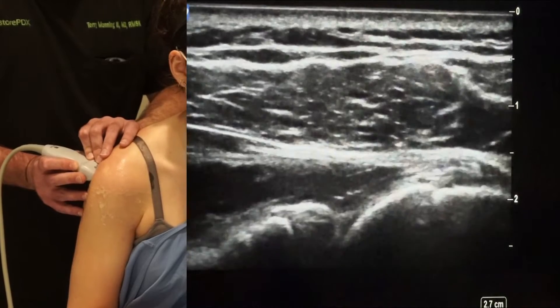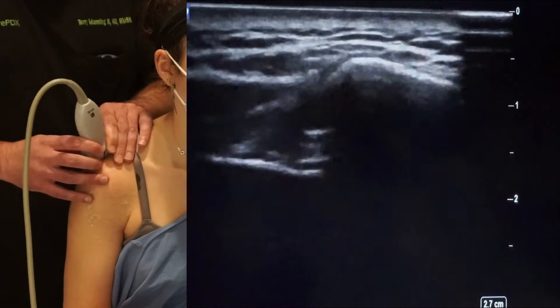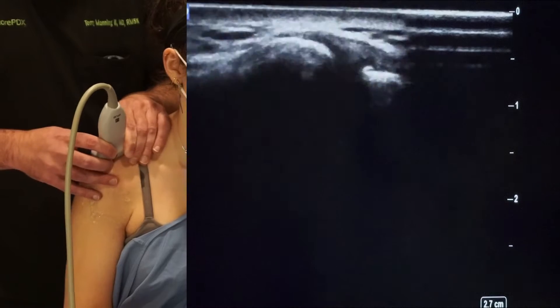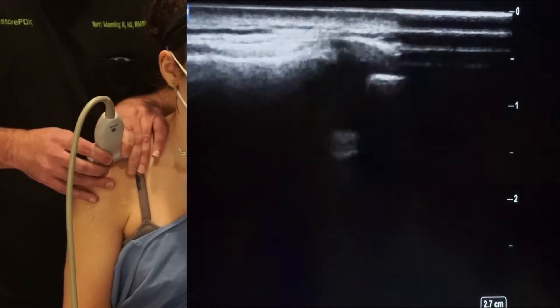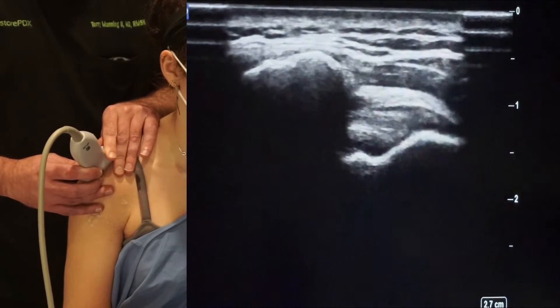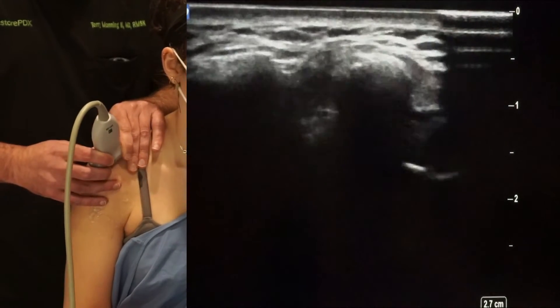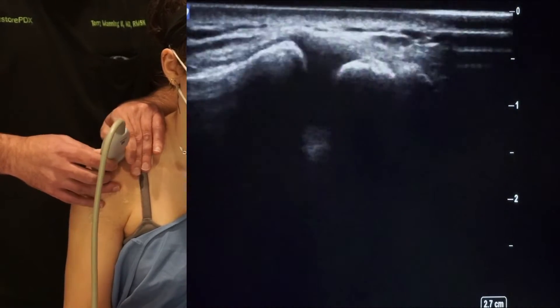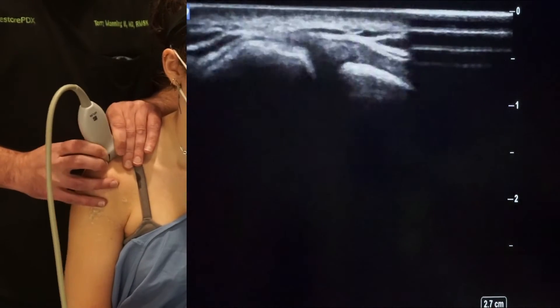Next, having looked at all the rotator cuff tendons and the glenohumeral joint, we go superior to assess the acromioclavicular joint. This is the clavicle; this is the acromion process. Lateral to the acromion you see the supraspinatus tendon, the bursa, and deep to that the humeral head. The AC joint is right there — nice and normal. We don't see any significant degenerative changes, no effusion, and no step-off defect.